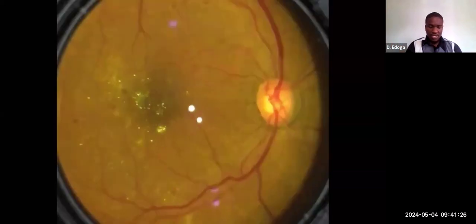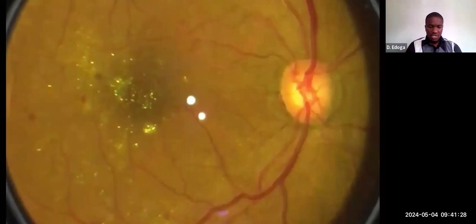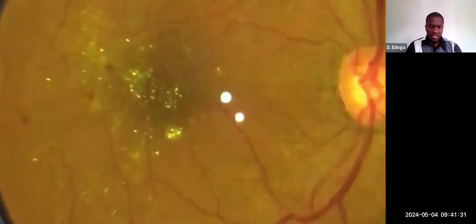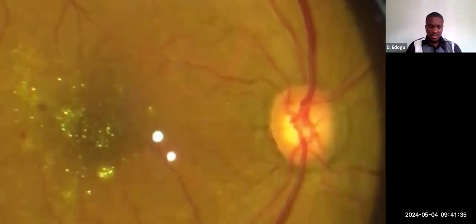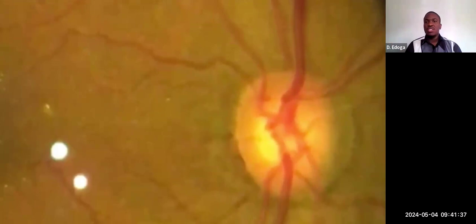And if I zoom in on the macula, you can see the hemorrhages, you can see the exudates, you can also see the optic disc clearly. You can zoom in more. So these are things that you can get with a smartphone.